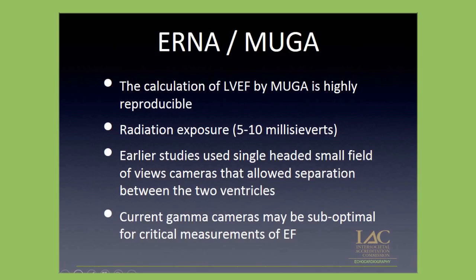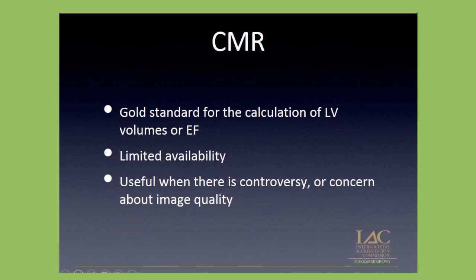In the good old days, we didn't care that much about it. Right now, we do care a lot. And as you may imagine, it's pretty counterintuitive to give radiation to somebody that already has cancer. That is the reason why right now we are not too excited about the use of this technique. Although if you are facing problems with the quality of images, and if you don't have MRI, then this may be a reasonable alternative.